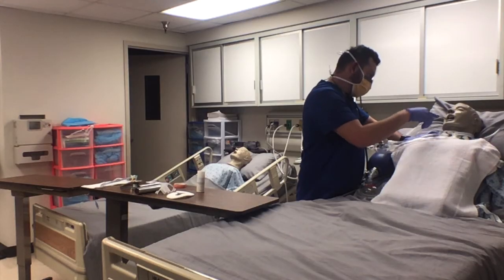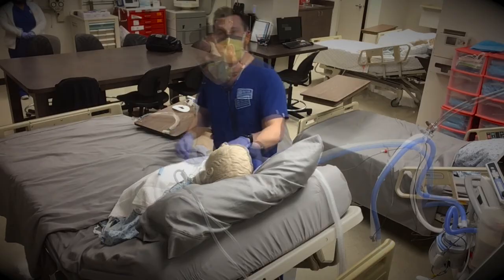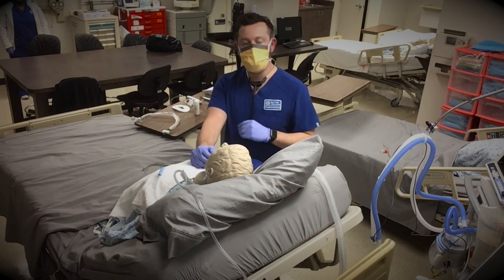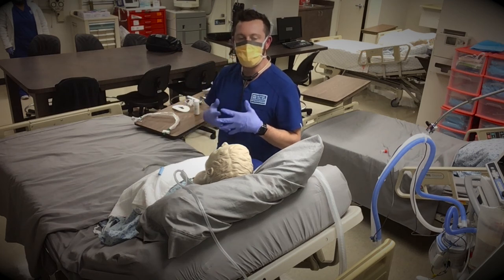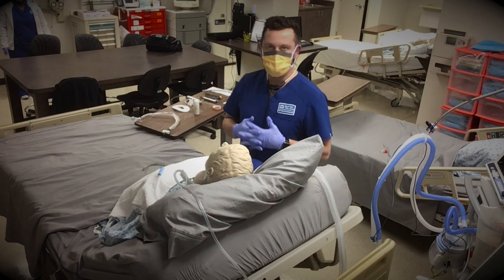And now the tube is out. I'm going to suction the patient and get no secretions. So now that I've got the patient extubated, I'm going to put the patient on oxygen and see how he responds now that he's extubated. And that is extubating your patient after being intubated.